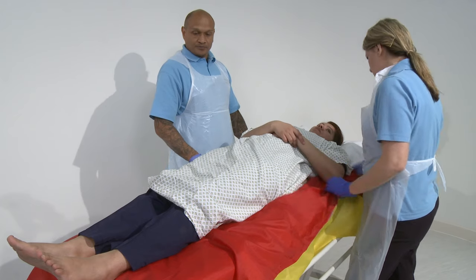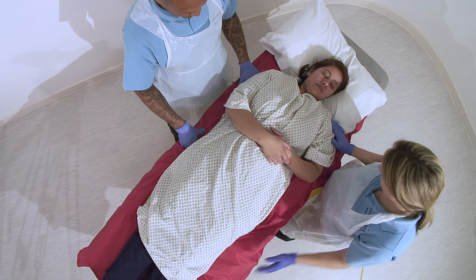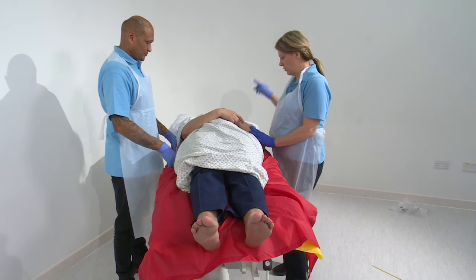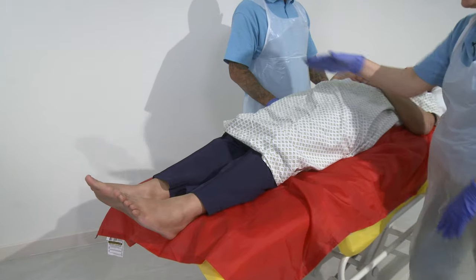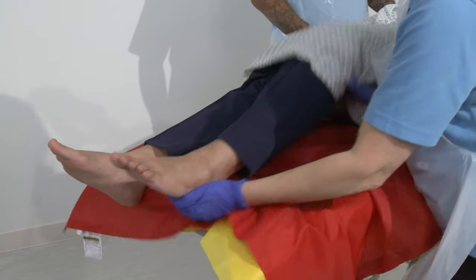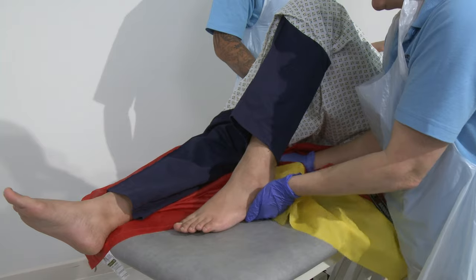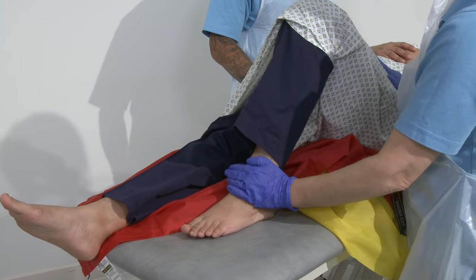Okay Niha, I'm going to see if you can do a little bit for yourself today. So what I'm going to do is just help you bring that leg back up and I want to see if you can push through. So when I tell you to, I want you to try and push that way, but I'm just going to help you up with that leg again. Flat hand in underneath the back of the knee, lunge forward and take hold of the foot, slide Niha's foot up, take hold of my slide sheet, take it away so that she has traction on her bed — I can support here.